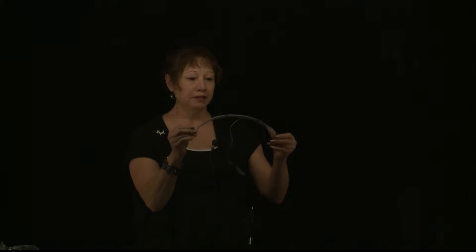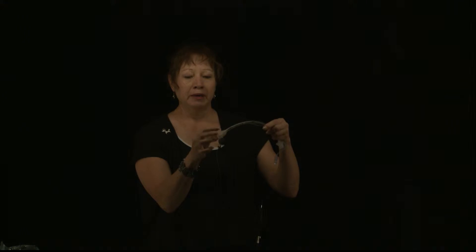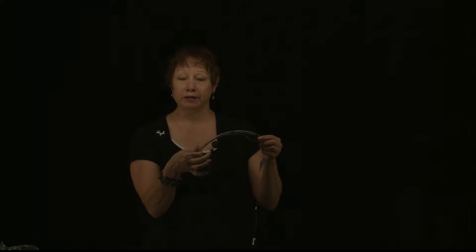This is a standard 6.0 endotracheal tube, and at the tip of the end of the tube we have the endotracheal cuff. This is the cuff that allows a tight seal in the trachea as it's placed. We want to take extra special care not to over-inflate this tube, because every animal has different endotracheal sizes in diameter, and a lot of damage can be caused by over-inflating. So we want to take care to be safe and not harm the animal.